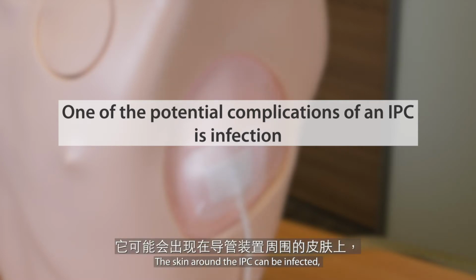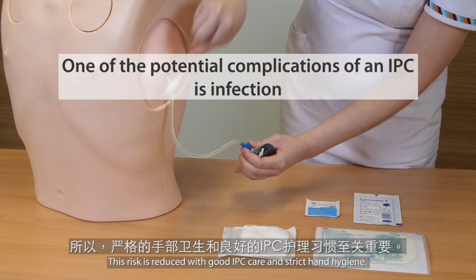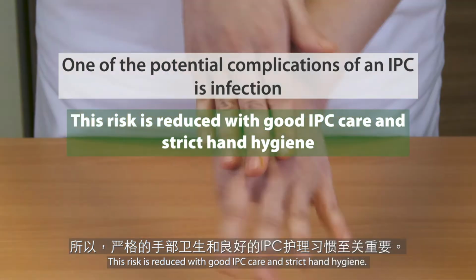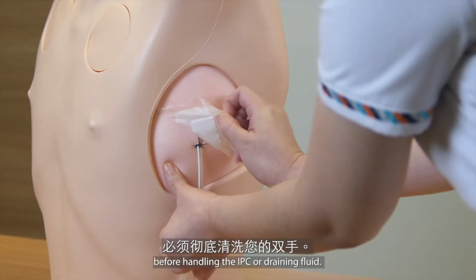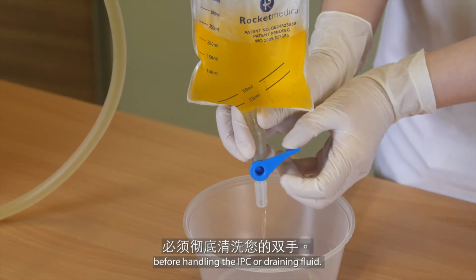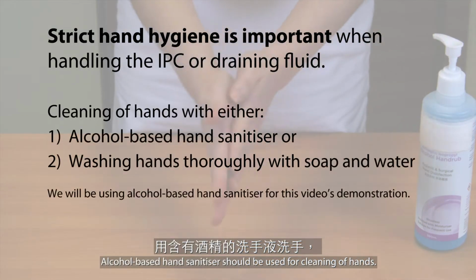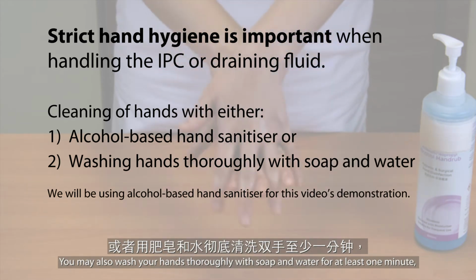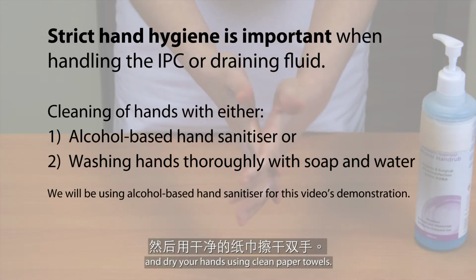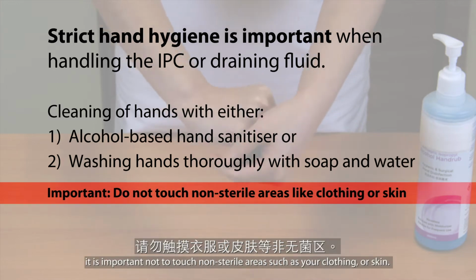The skin around the IPC can be infected, or bacteria can enter the chest through the IPC. This risk is reduced with good IPC care and strict hand hygiene. Therefore, it is important to clean your hands thoroughly before handling the IPC or draining fluid. Remove any rings. Alcohol-based hand sanitizer should be used for cleaning of hands. You may also wash your hands thoroughly with soap and water for at least 1 minute, and dry your hands using clean paper towels. Once your hands are clean, it is important not to touch non-sterile areas such as your clothing or skin.